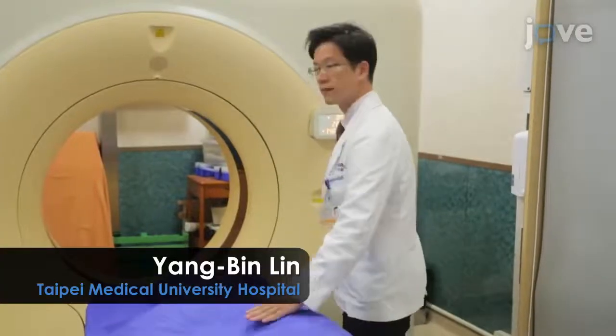Demonstrating the procedure will be Yang Bin Lin, a technician from our department.